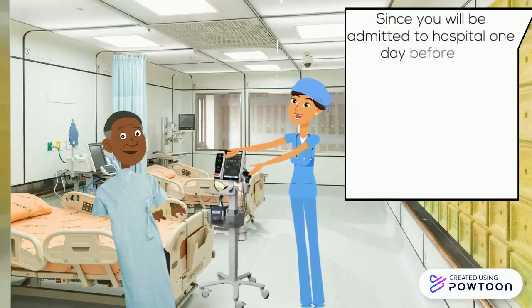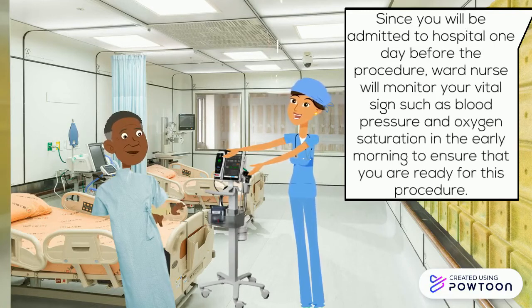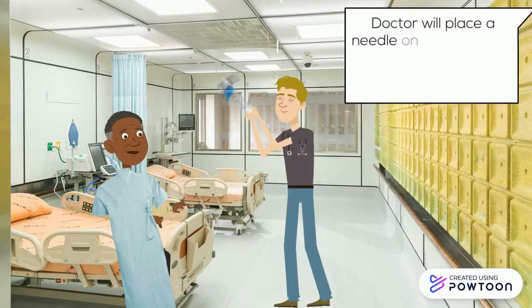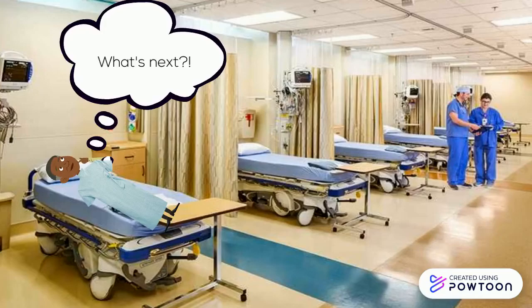Since you will be admitted to hospital one day before the procedure, the ward nurse will monitor your vital signs such as blood pressure and oxygen saturation in the early morning to ensure that you are ready for this procedure. The doctor will place a needle on your arm and you will then be sent to the angiography unit, wearing a hospital gown. You will then be sent to the waiting area at the angiography unit.